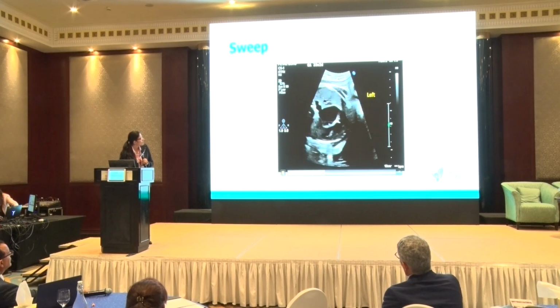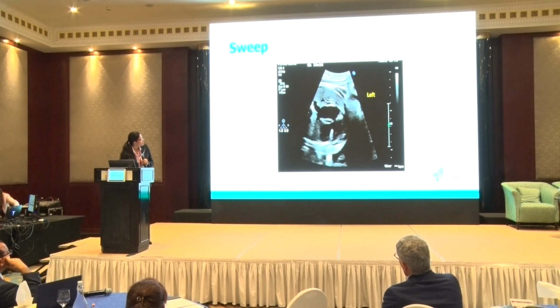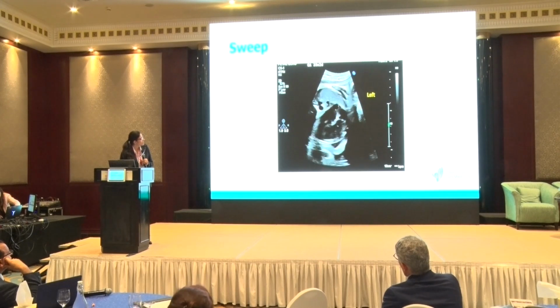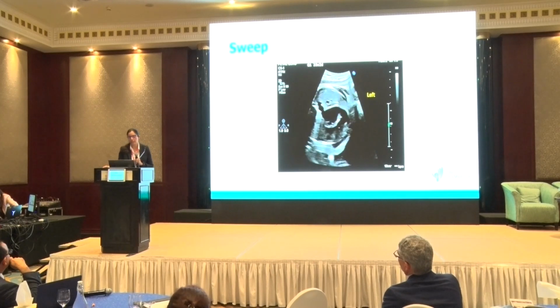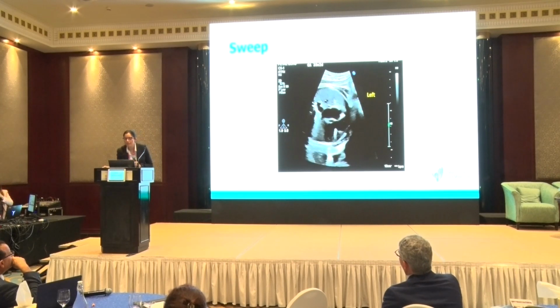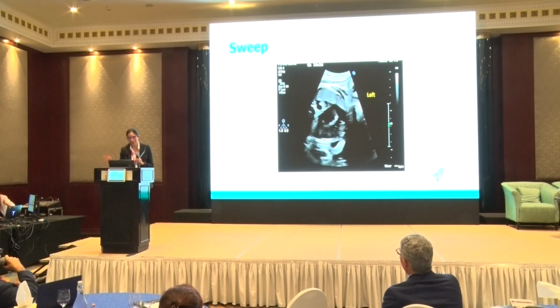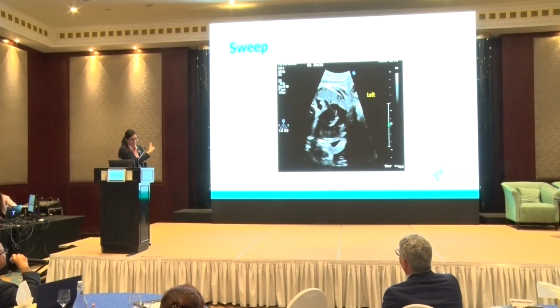Here. No, it is here. With a hypoplastic pulmonary artery. So I don't have the color flow, but when we put color, there was a reverse flow. So this baby was born, and this is confirmed, had a kind of duct-dependent lesion, and now has a PDA stent. Yeah, I have to say, I do optimize as much as possible. I was going to say, this was a late scan.